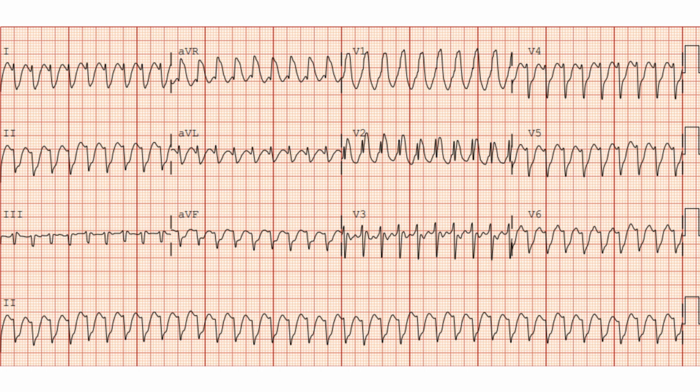If someone has SVT with aberrancy and they have an underlying bundle branch block, if you speed that up, it can look like ventricular tachycardia. So there are many EKG signs and different rules and algorithms to help you determine which one is VTAC and which one is SVT with aberrancy. Don't put too much weight on those, okay? They're not good. If you look up the data on them, they're not always 100% sensitive and specific, and VTAC is a deadly issue, okay?